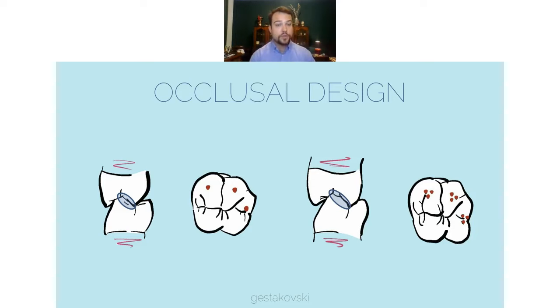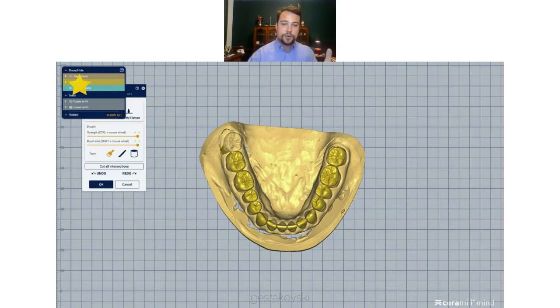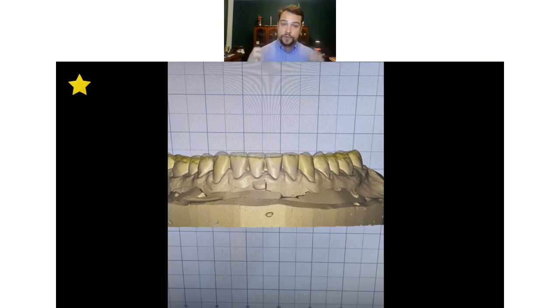protrusional and lateral motions. After our technician made such wax up, here you have one wax up with the occlusal tables, with partial veneers, with raised bite in the new referential height, which is depending on the aesthetical analysis and the aesthetical parameters, everything captured in the centric relation.